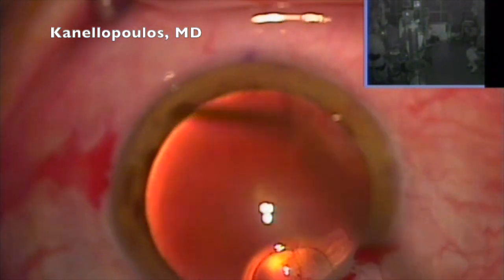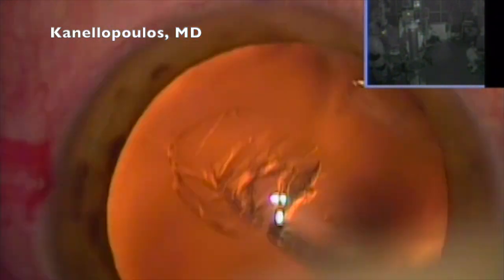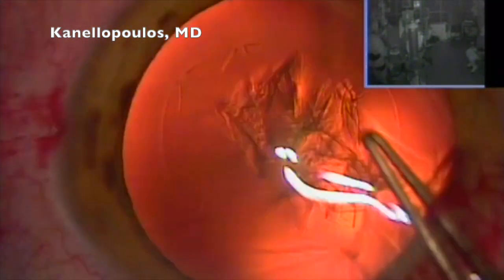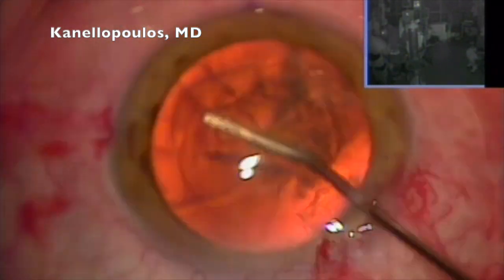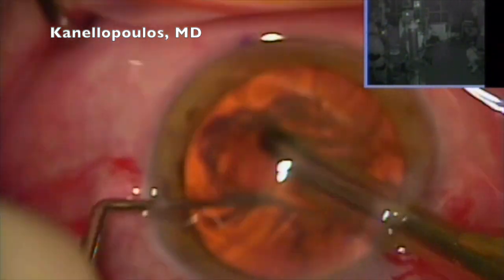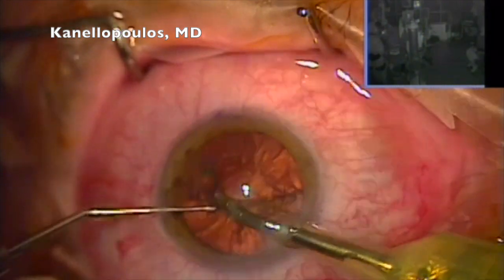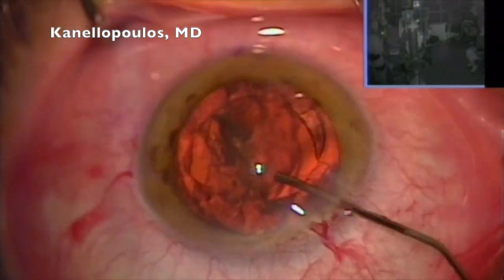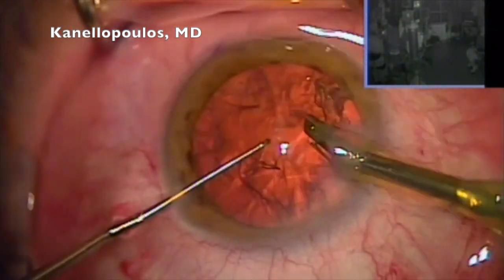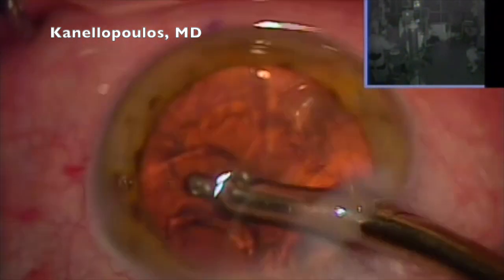Same story, different patient. Again, this is a non-toric lens. So a record for us today, I think we're seeing here 8 cases, and 2 or 3 of them are non-toric, which is unusual. Usually we're 90% toric, as I mentioned before. And I'm going to reiterate the fact that we're playing with blended vision, plano to minus 0.4 in the dominant eye as endpoint, and minus 0.75 in the non-dominant.